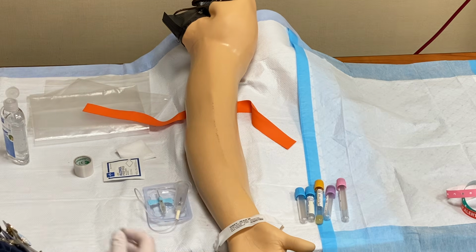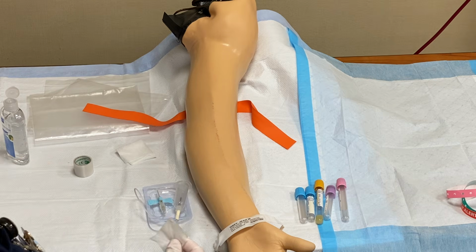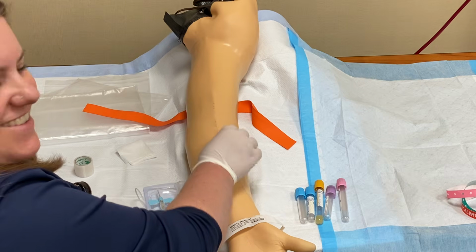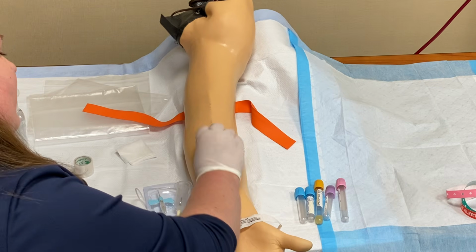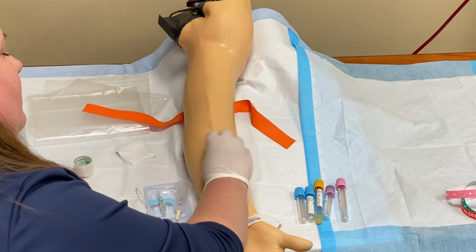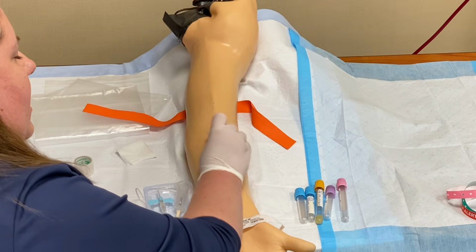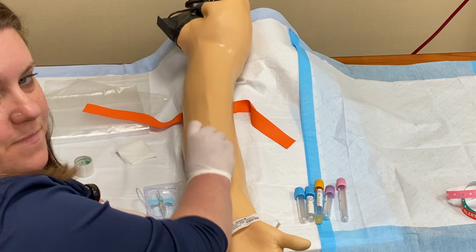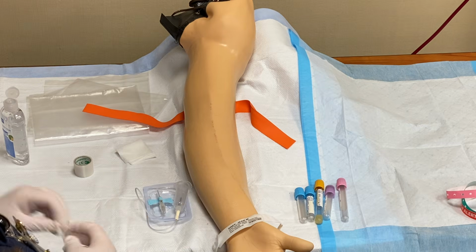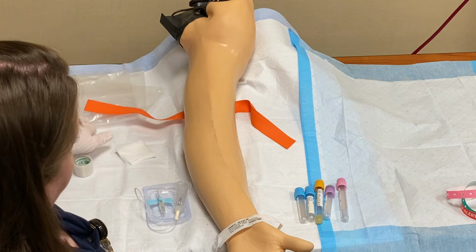All right, I'm gonna get my second alcohol swab ready. And watching the clock, I'm gonna clean for another 15 seconds. Making sure that I'm scrubbing and using good friction to get any potential germs off. All right, that's my second 15 seconds. I now need to let the alcohol dry.